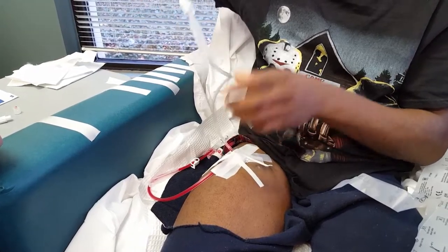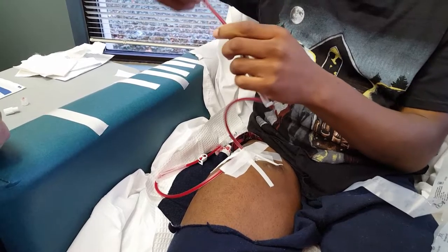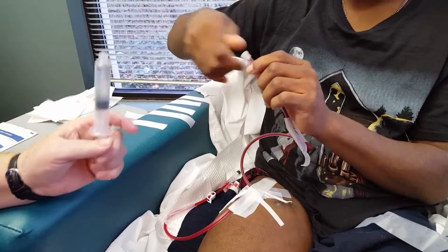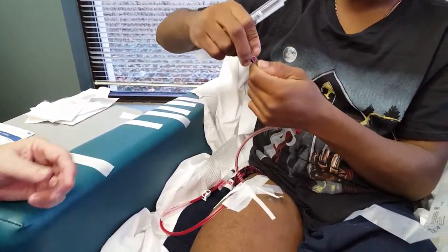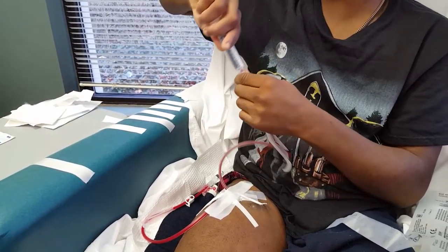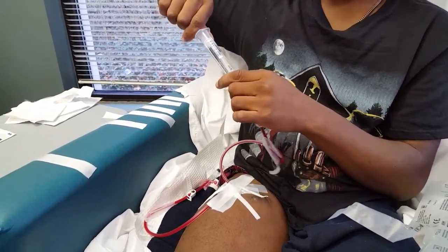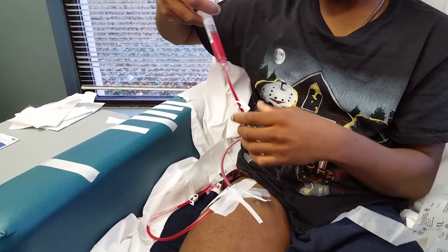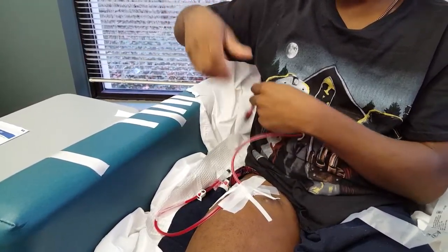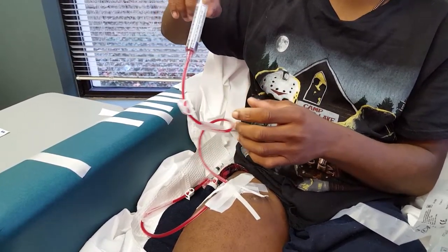Now, take this one and flush it. You have to prime it first. Prime it. Well, you have to say that because that's what you do. Then we flush it. I always forget what it's called. Saline. Priming the line? Yeah. We don't need this out anymore. And I just flush that, clamp it. After that I'm going to put a little bit more in there. Okay, now we're ready.